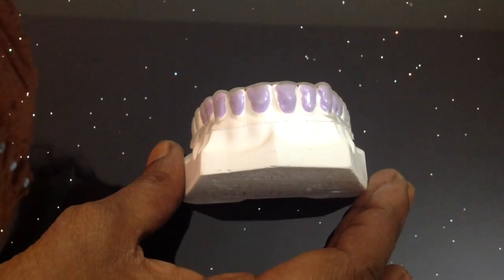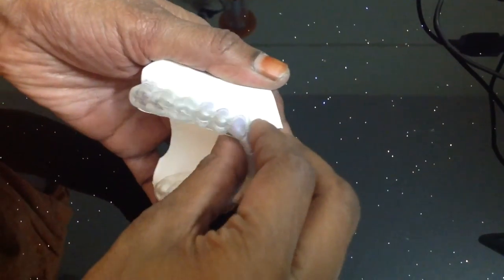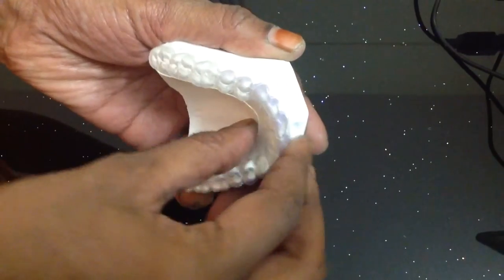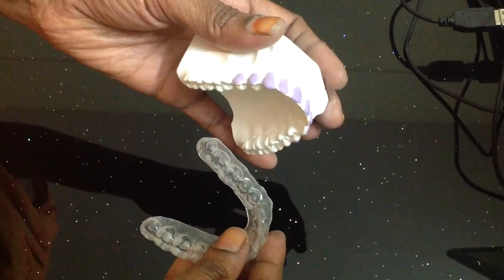The first and most basic variety of bleaching tray is made by using the ErcoSkin as spacer. This is the economical type of bleaching tray, most widely used, and very quick to fabricate.